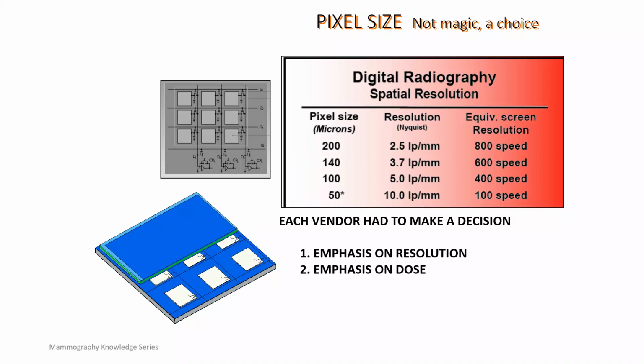So which size would take longer or more energy to fill? 4 big DELs or 1,000 little tiny ones? Obviously, it's easier to line up the 4 big DELs to begin with and fill them as opposed to the little ones. So when we talk about resolution and size and equivalency, what we're looking at is what intensity or amount of X-ray do we choose.